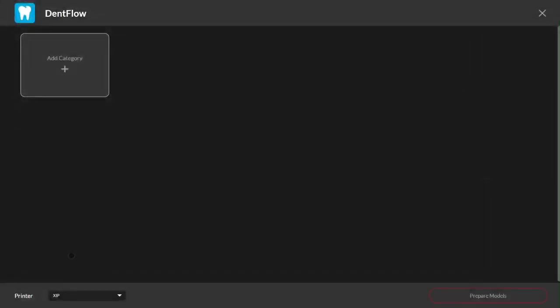DentFlow is a user-friendly wizard for dental professionals that quickly automates the build preparation work for our entire suite of printers here at Nexa3D.